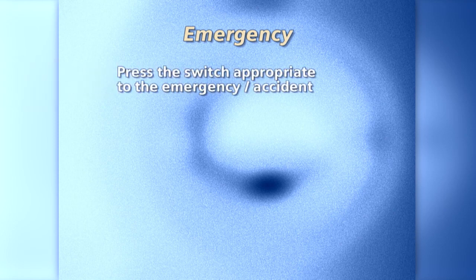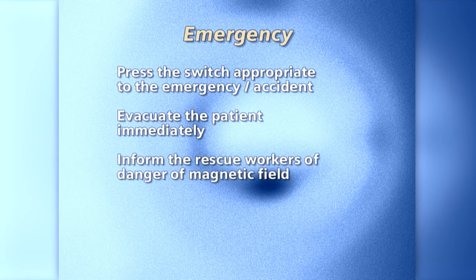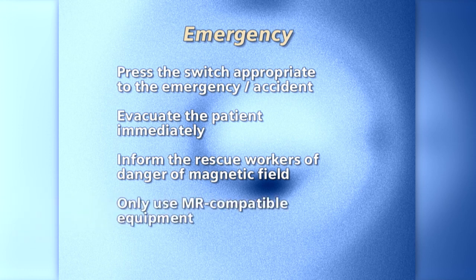Emergency. Press the switch appropriate to the emergency or accident. Evacuate the patient immediately. Inform the rescue workers of danger of magnetic field. Only use MR-compatible equipment. Document the emergency or accident.